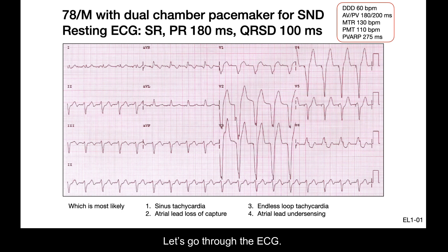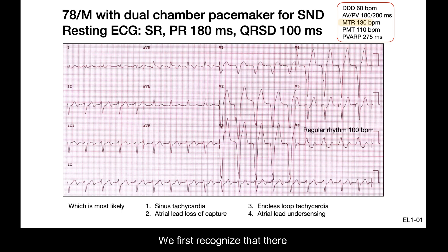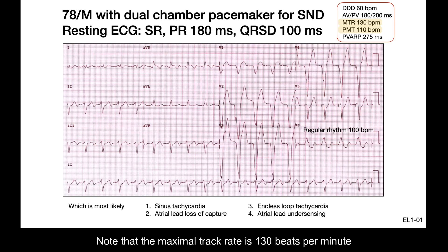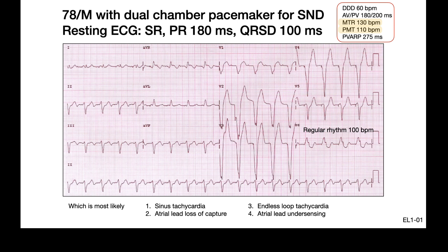Let's go through the ECG. We first recognize that there is a regular rhythm of 100 beats per minute. Note that the maximal track rate is 130 beats per minute with a PMT rate of 110 beats per minute.